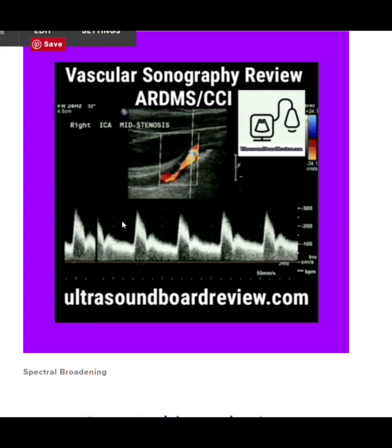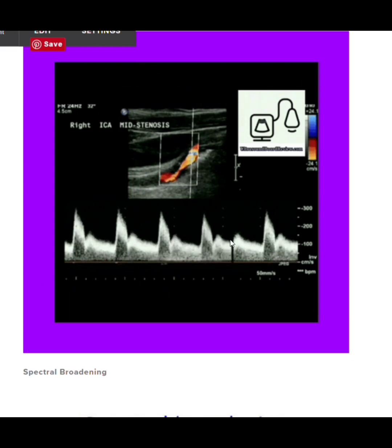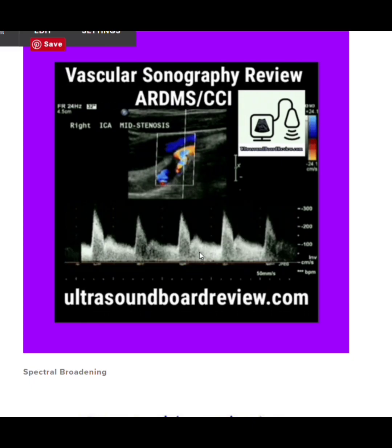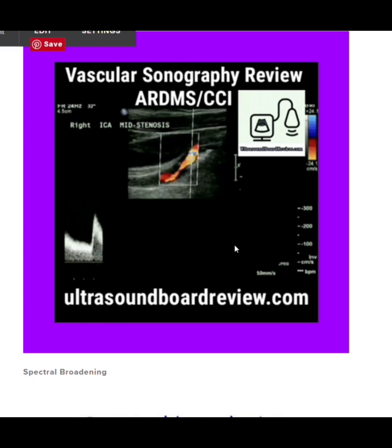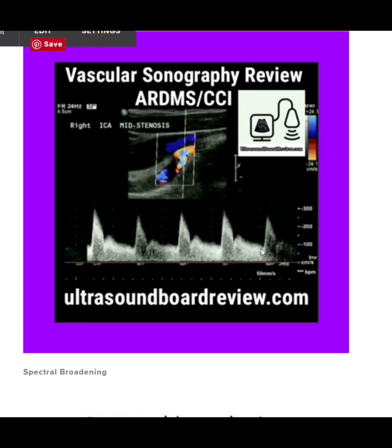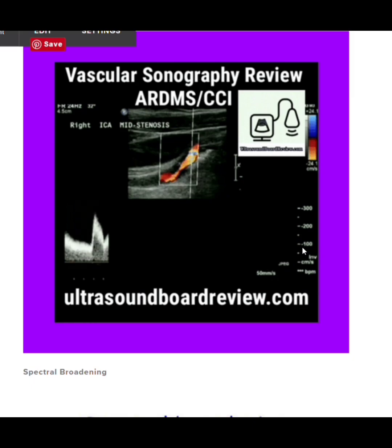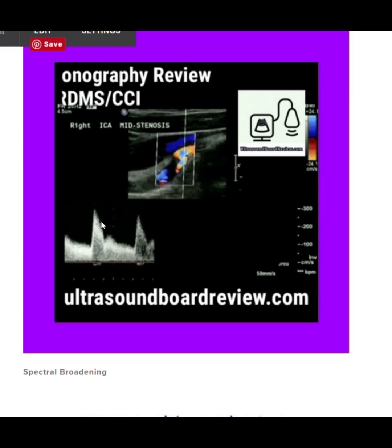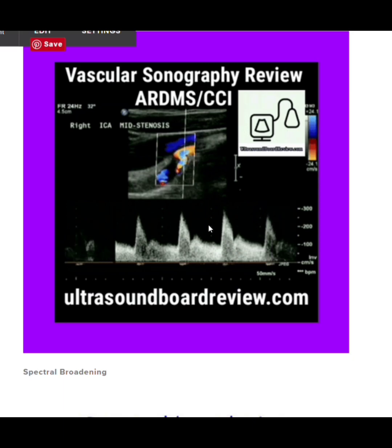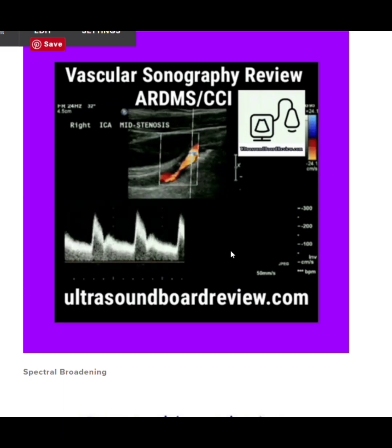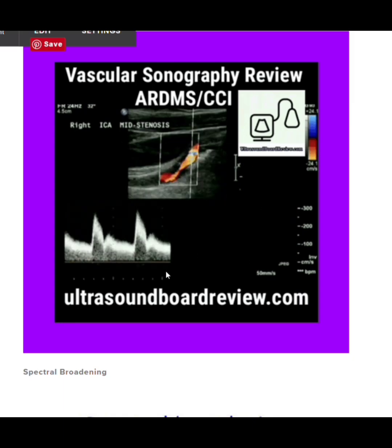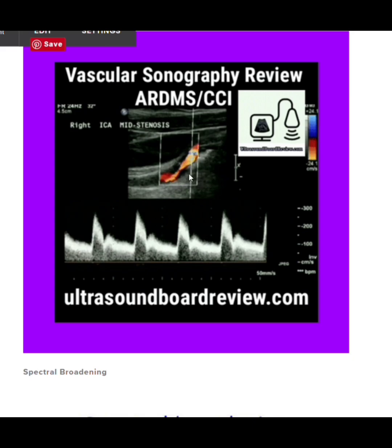This waveform is characterized by abnormally high velocity with abnormally low resistance. We know it's low resistance because there's blood flow in diastole, but it's abnormally elevated — with a peak diastolic velocity of 100 cm/s and a peak systolic velocity approaching 300 cm/s. This indicates a significant stenosis in the exact area being evaluated.